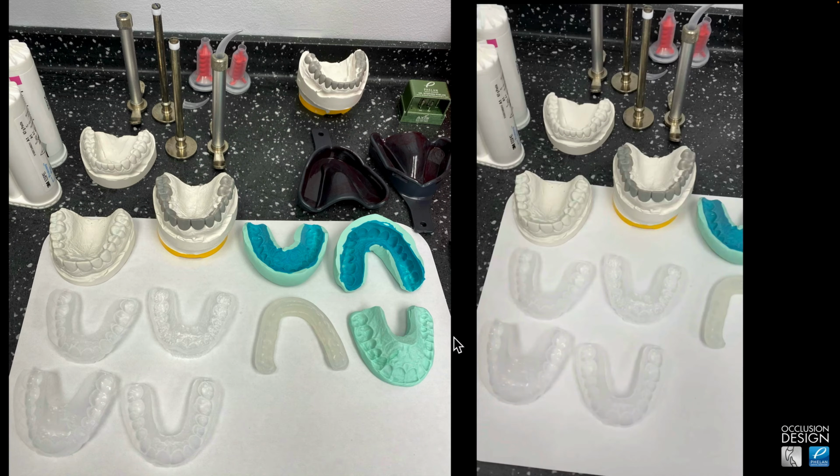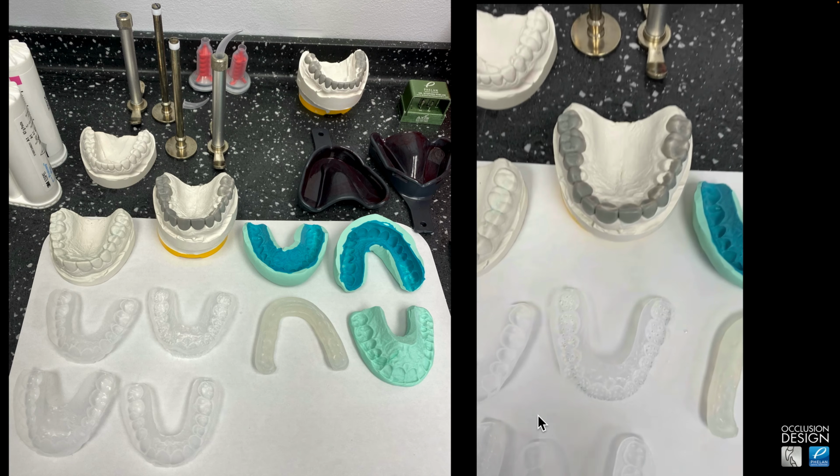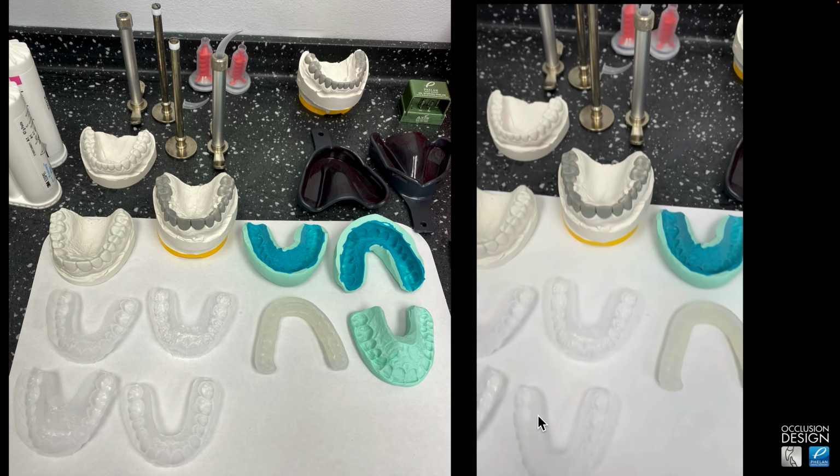So we finalized that. Here's everything ready to go. You can see a better version of the wax up. We have a duplicate model of the wax up, and then all the putties and stents I used to check the preparations and basically make the provisionals. So here's just a little video of all this for day one.